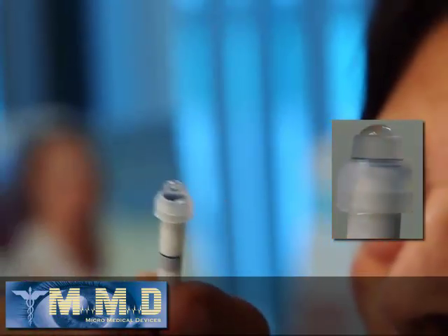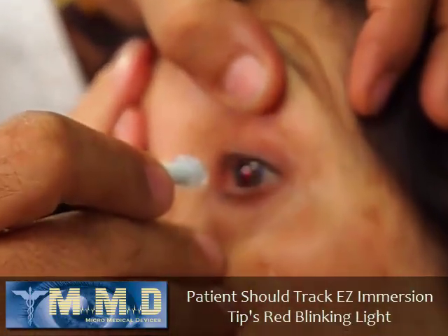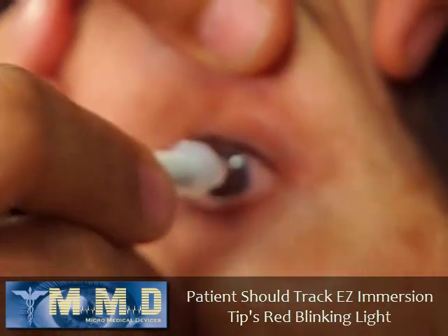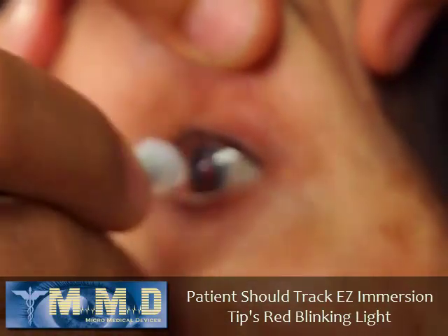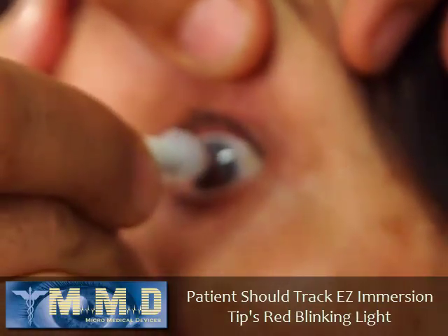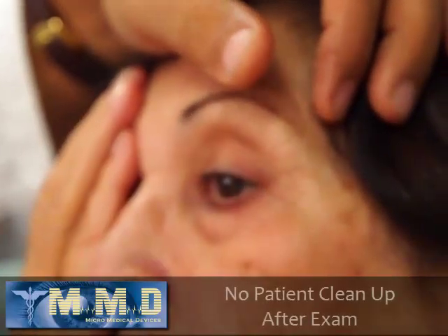Now I'm going to do the left eye. The main thing to remember is if the machine is not capturing when you touch the eye, don't press on the eye. Just hold it stable and ask the patient to look at the blinking light. I move it a little bit to make sure the patient is fixating properly and then just bring it close enough — and then you're done.